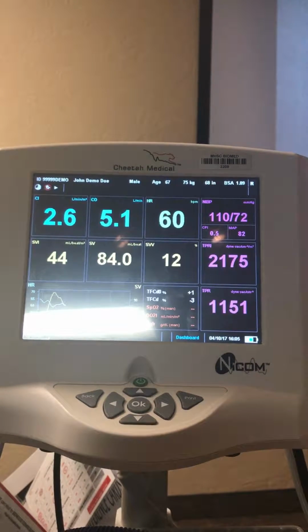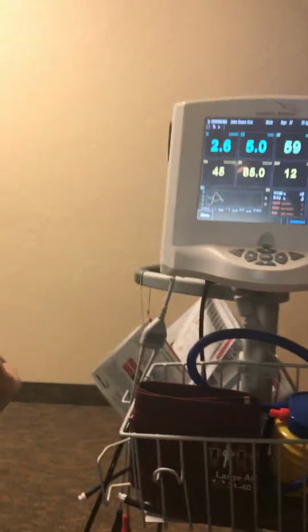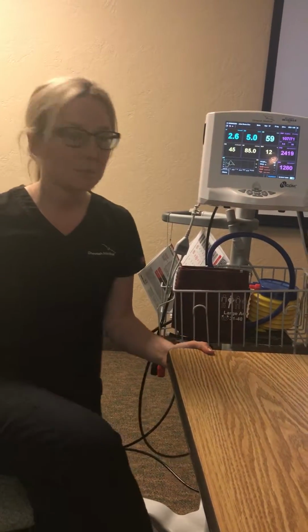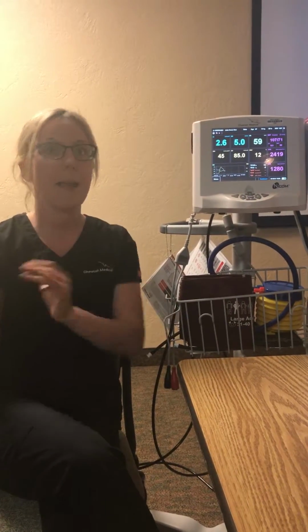Now there's three ways to find out if our patient is preload responsive, meaning will fluid help with perfusion, because that is our goal. We're not trying to maintain a blood pressure, we're trying to maintain perfusion. One is the passive leg raise, which we didn't create, we just have a way to standardize it where we lift the patient up for 3 minutes, head of bed 30 to 45 degrees, legs of the bed flat, SCDs turned off. Don't titrate any pressors, any sedation, any vent settings.